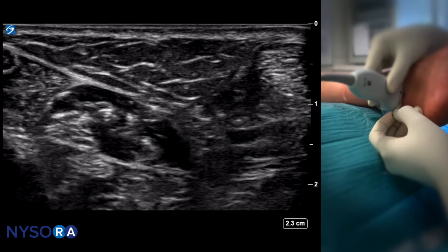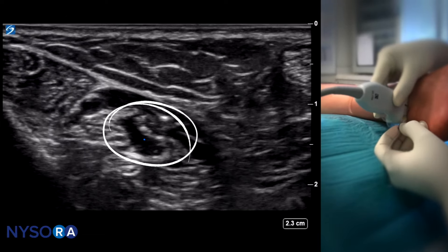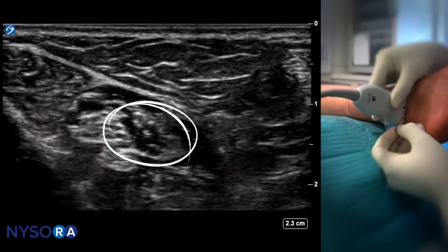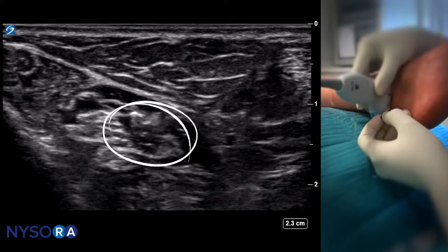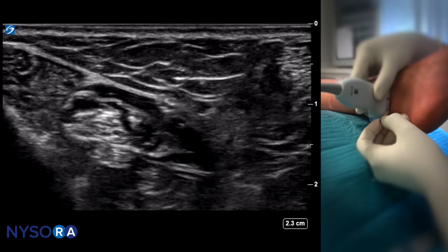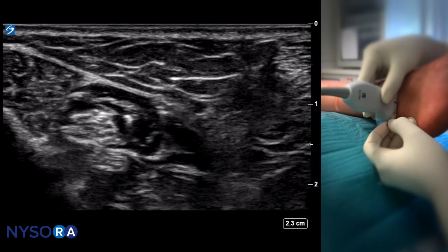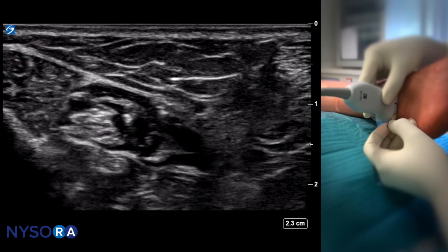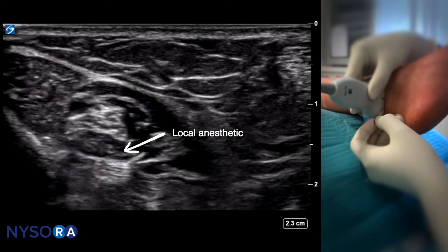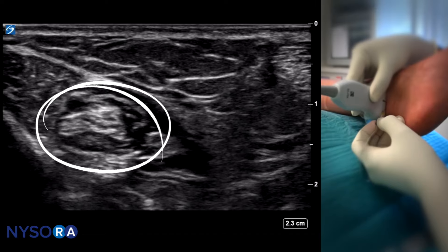We can see the tip of the needle, and the only time we will move that tip to another location is if we create a space with the local anesthetic and then place the needle a little deeper into that space, to make sure it doesn't accidentally exit the space. Again, every time we start an injection the pressure is low, and you can see how the local anesthetic injected there basically just fills that space — a demonstration of how nerve block is an injection of local anesthetic into the space that contains the nerve.